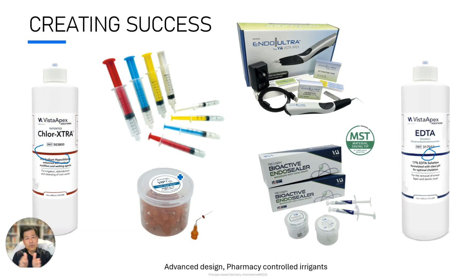If I have to do a core buildup, I may block out the core area if the tooth structure is missing in that area, or I will let the restorative material fill in the core. Let's say I'm doing an Emax crown or zirconia crown. I'll have the crown, and the underside of the crown will have the core attached to it, right? So it's going to be super strong with a lot of great retention, and then I'll just bond the whole thing in.